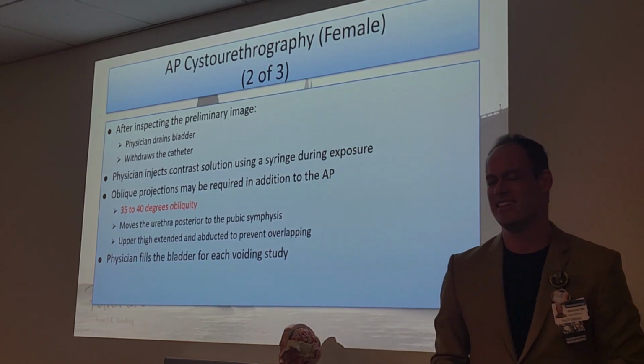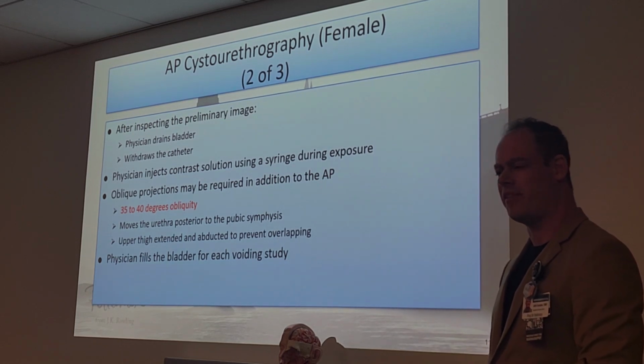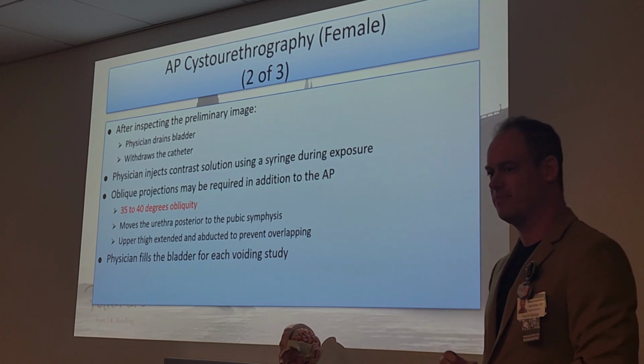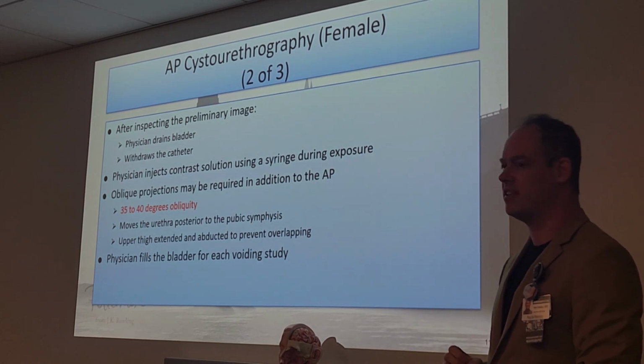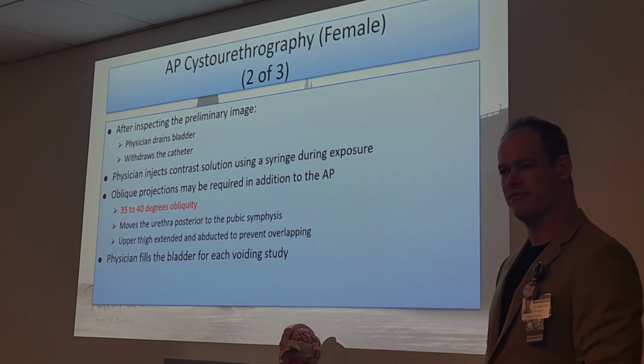But if the patient is in good condition, why can't they just use a bedpan? Because it would get in the way of what they're trying to see. They're going to actually fluoro while they're urinating. Okay, I thought they just wanted to see them pee, like just pee.